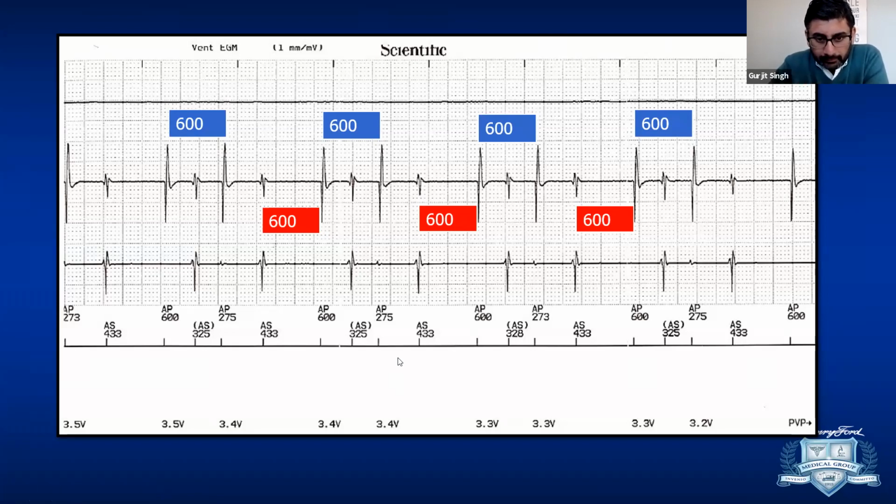Okay. So we have changing the rate, but we have decreasing the sensitivity. So changing the rate will not help because the faster the rate or the slower the rate, you will still sense the ventricular activity on the atrial channel. But yes, we have to decrease the sensitivity, which means you have to raise the fence so you don't see this far field in the atrial channel, and you can complete your threshold testing. So this is an example of oversensing or far field sensing.